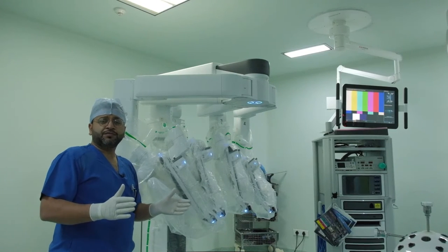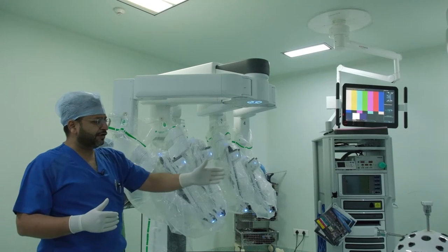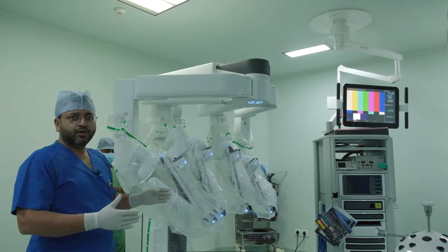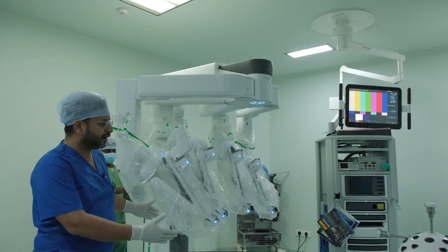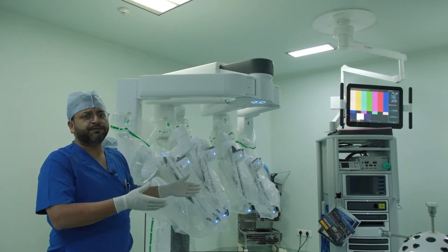Now we select the anatomy. I will request Mr. Roshan to select the pelvic anatomy, as we have a pelvic model here, and select patient's left. What that means is the patient cart is coming from the patient's left, and we have the pelvis of the patient in front, and we want to do a pelvic procedure.